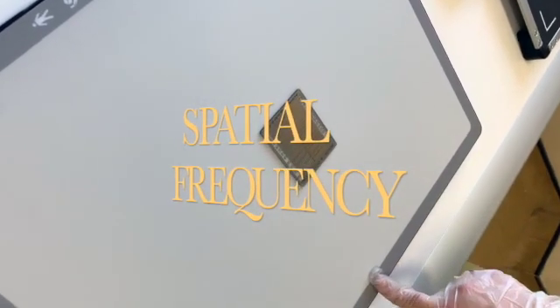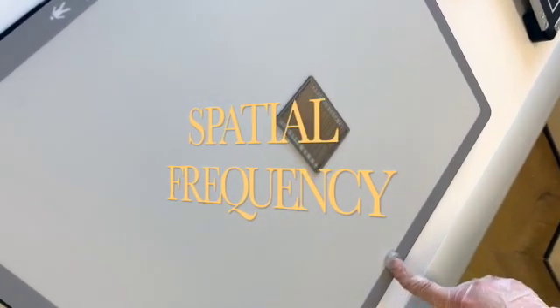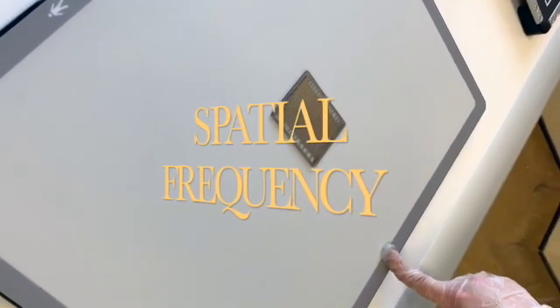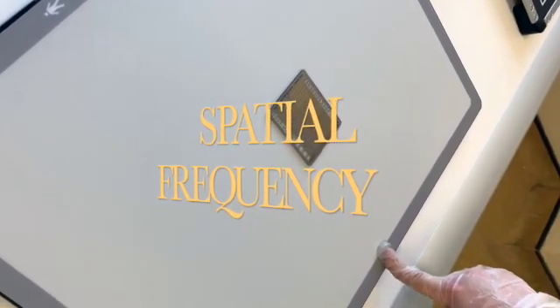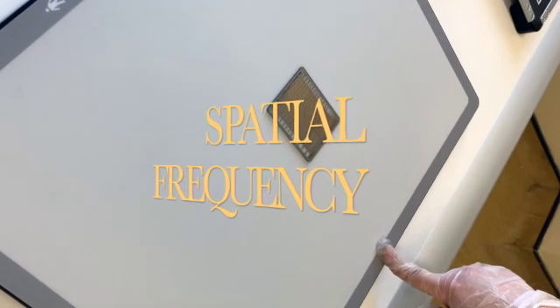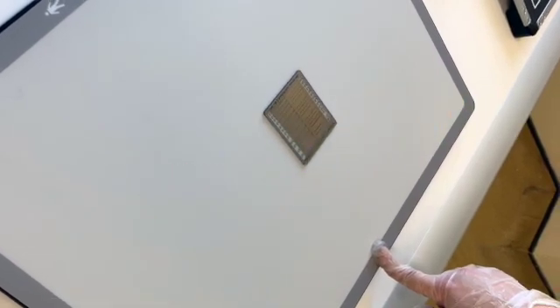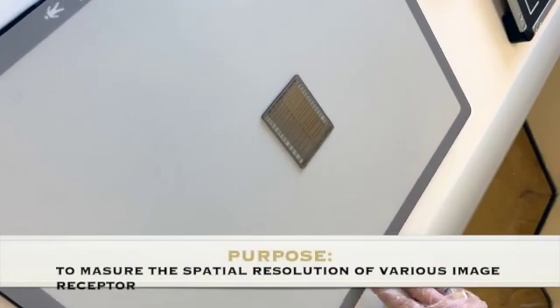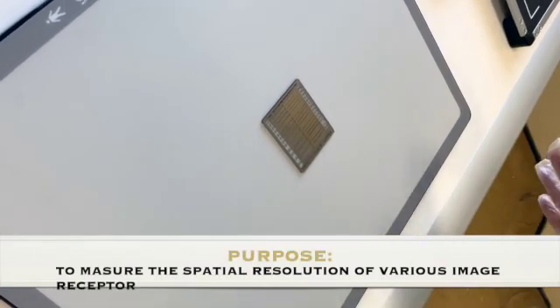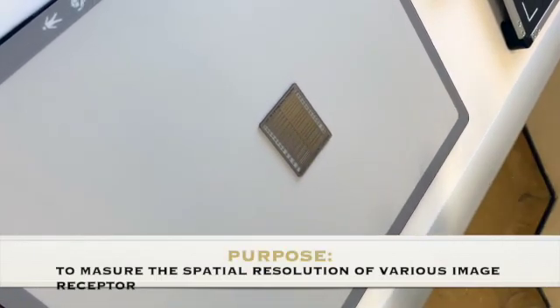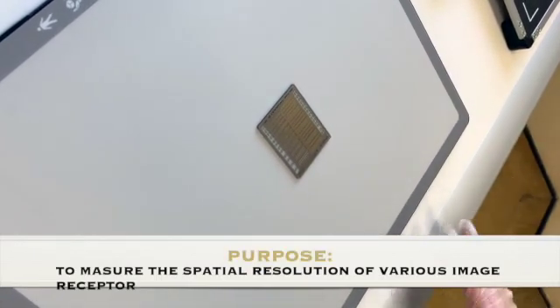Now we are doing experiment number one, which is measuring spatial frequency. This experiment is used to measure the spatial frequency of various image receptors.